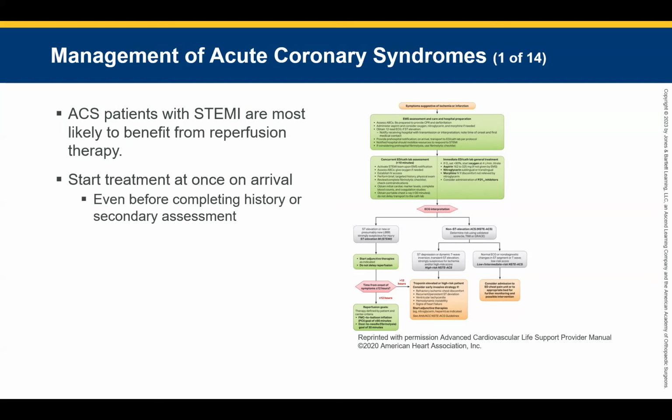So first thing I would say is check your leads. Are they in the right spot? Check your leads. That's the first thing. Second, after that, take a deep breath and start taking your patients to the cardiac center. You don't have to freak out. Just start getting to the cardiac center. And then if they get worse, because you're going to do continual trending 12 leads, if you start to see it get worse, upgrade.